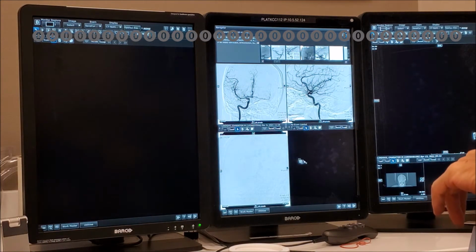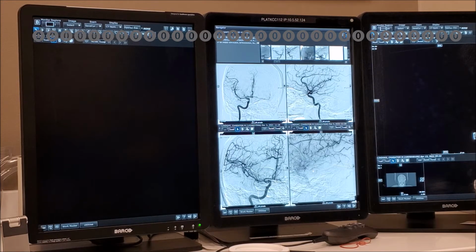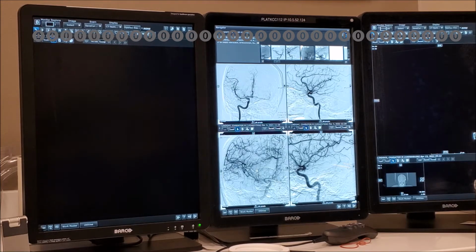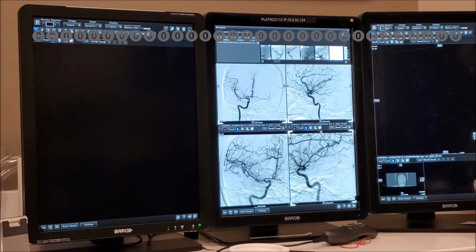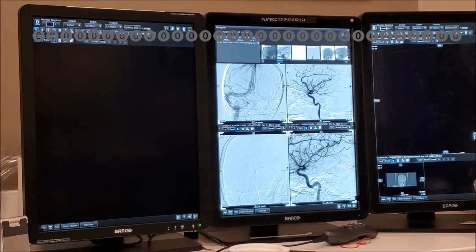She's having trouble working, difficulty sleeping, and she had an MRI externally, which we don't have, suggestive of some vascular malformation on the left side. She underwent a diagnostic angiogram, I think, earlier this year, which you've got up at the moment, I believe, and then had a treatment on Monday just gone. Okay.